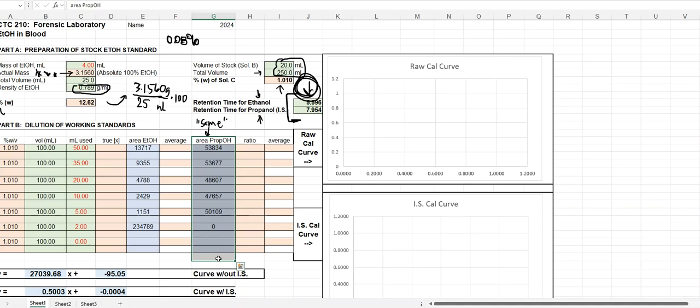And we've got to use that number in math. And that math formula is going to divide by the internal standard. You cannot divide by 0. Doesn't make any sense. So that is going to eliminate standard number 1. We will not be able to use it at all. And it's simply because they forgot to do that one simple little step.